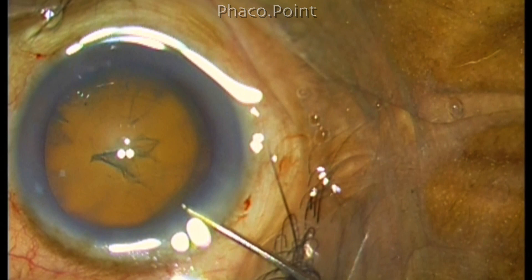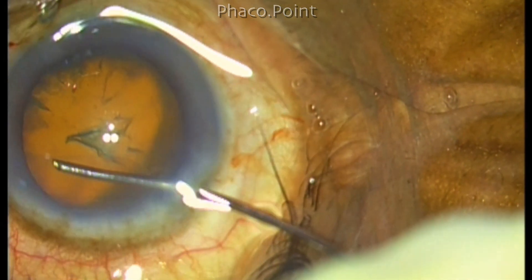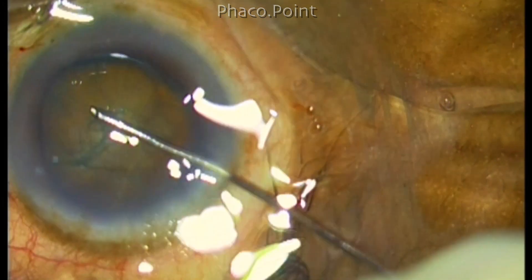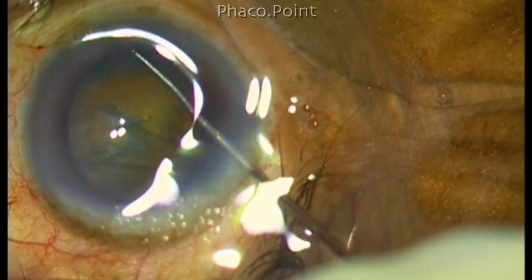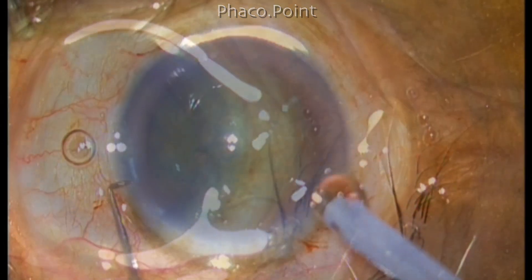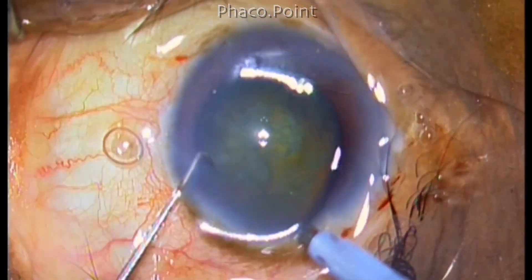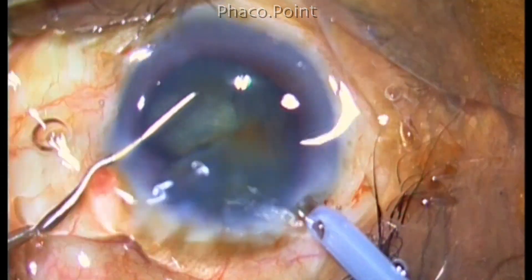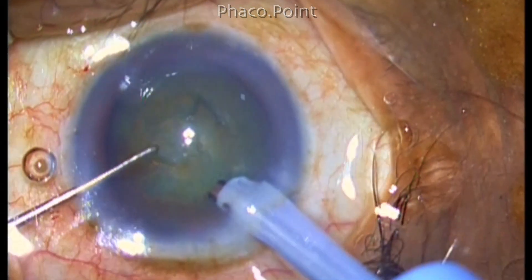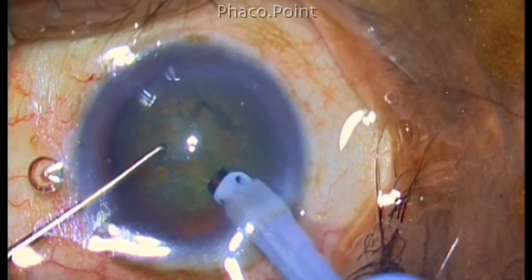So now I'm performing the cortical cleavage hydrodissection. The fluid wave you can see has passed well and this nucleus will rotate. There's also a slight rise in the central part of the nucleus. So the procedure of phacoemulsification is going to be a direct phacochop with a power setting of 30% and using the micro pulse setting.